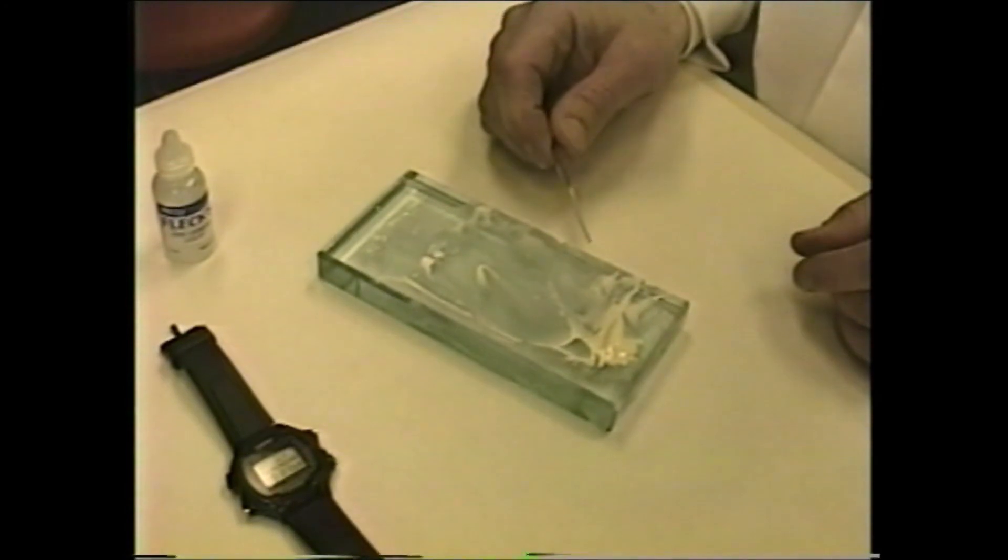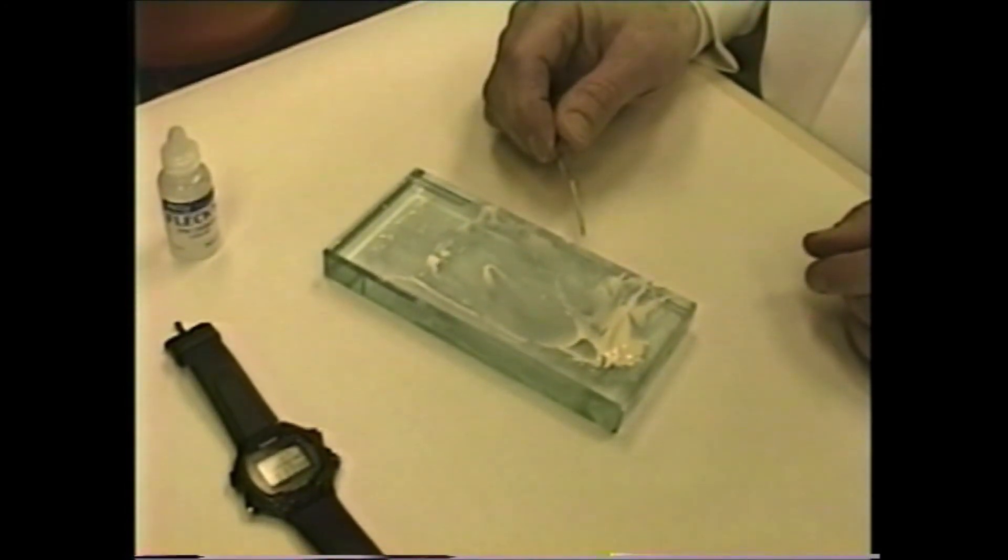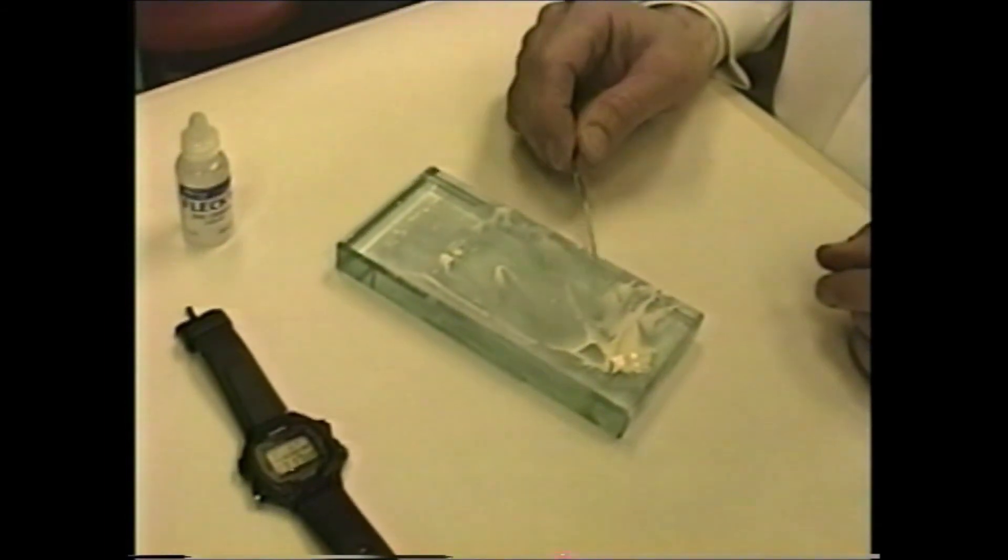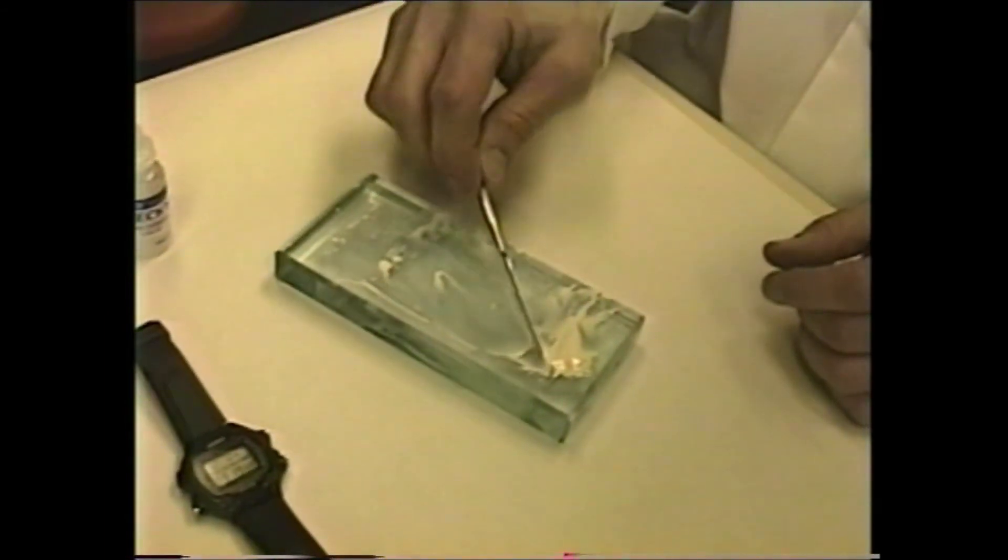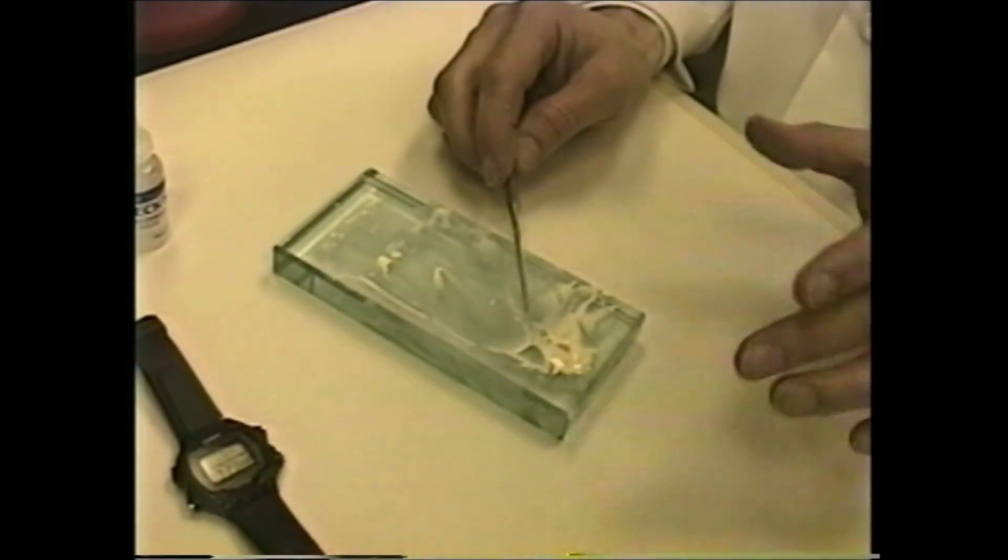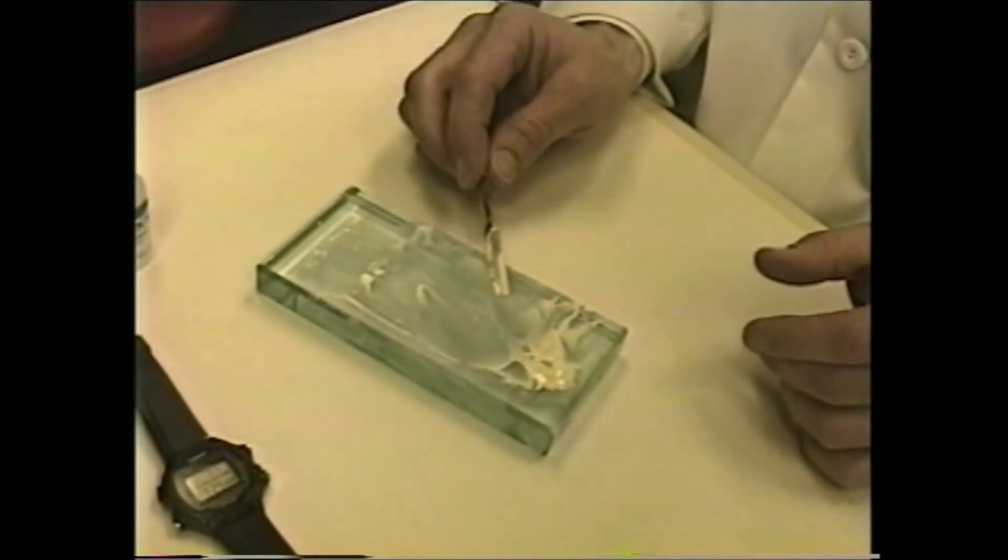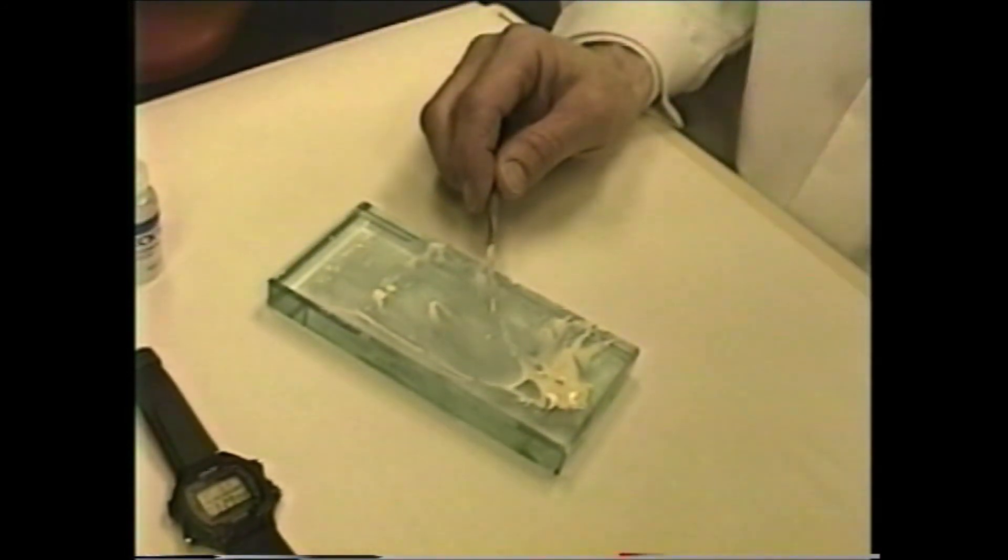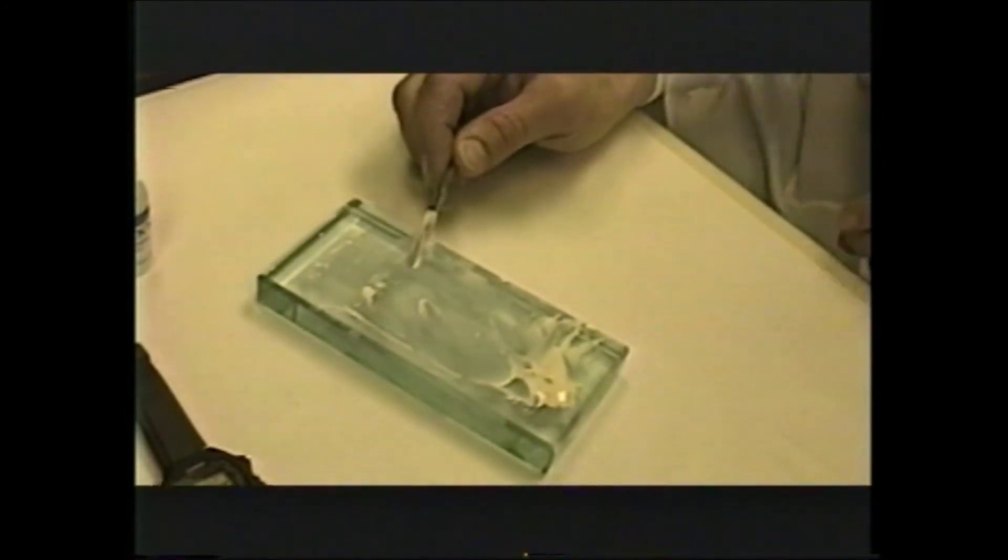One thing that's important is the proper cleanup. You can note the syllabus instructions for that. One thing you do want to do after the crown has been loaded and you proceed with cementation is place the cement slab along with the mixing instruments in water. Typically, it will clean up nicely in water.